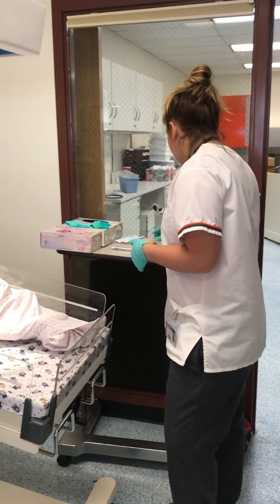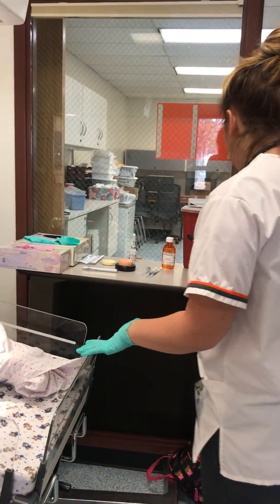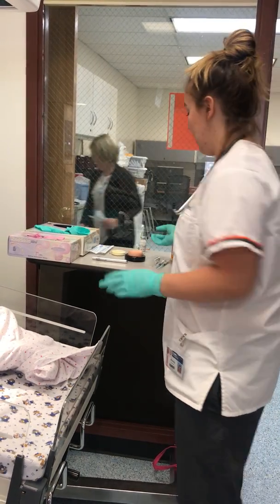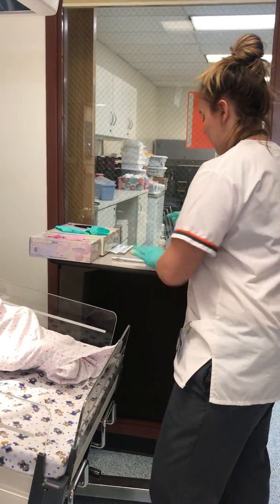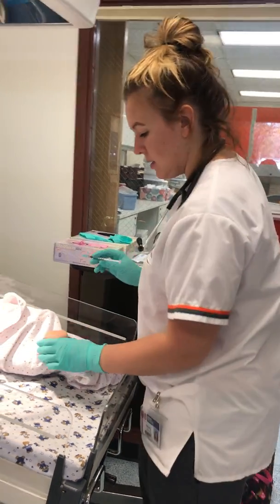So when I go to give my injection, I'm going to have an alcohol prep here, which I don't, but I would clean off the top of that, and I already have these drawn up. Then I would clean off the skin. I'm going to uncap this, come over here, and it's clean.